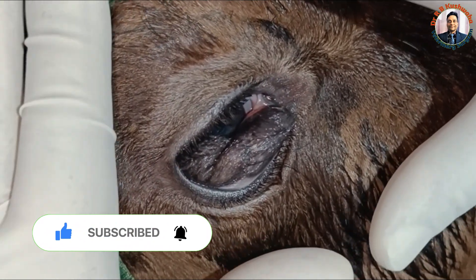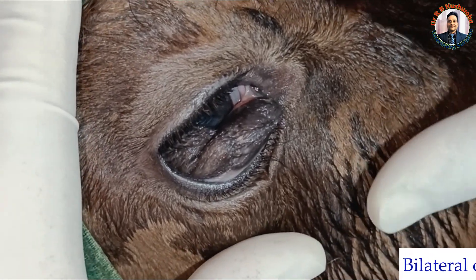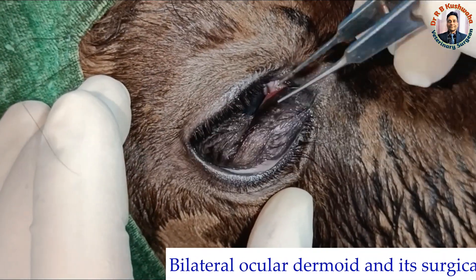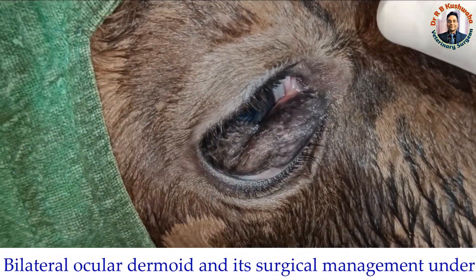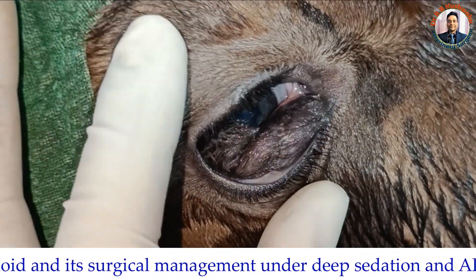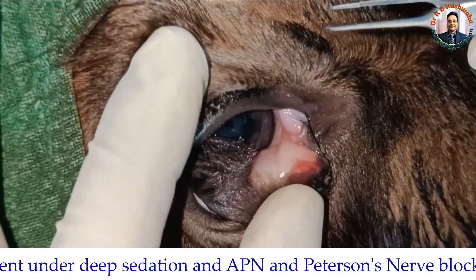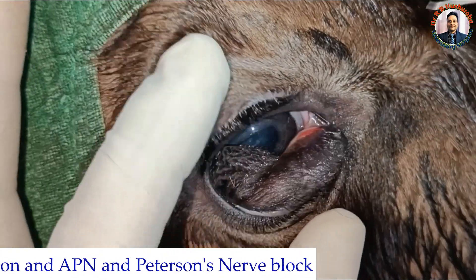Today we have a case of bilateral dermoid in a 20-day-old cow calf. Dermoid is a benign congenital abnormality in the eye with growth of skin, hairs, or some other structures. Normally in most cases it is attached with the cornea, but it may also attach with the conjunctiva, eyelid, or third eyelid.